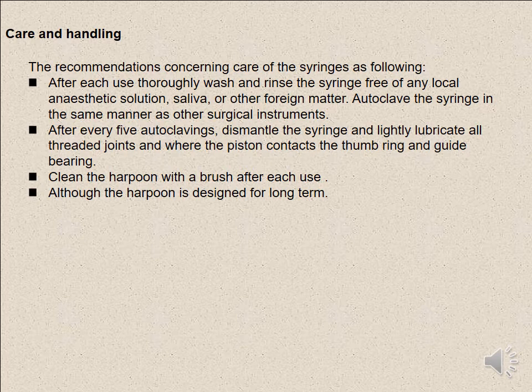The thumb ring is movable. So when you put oil on it, it can easily be used to open and close. Clean the harpoon with a brush after each use. And finally, the harpoon is also designed for long term use.